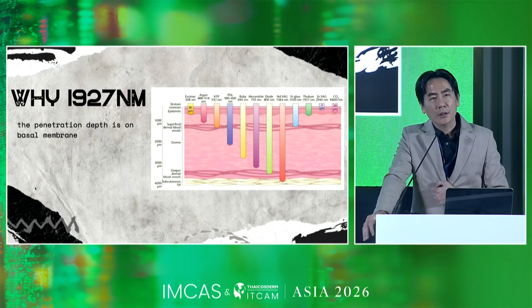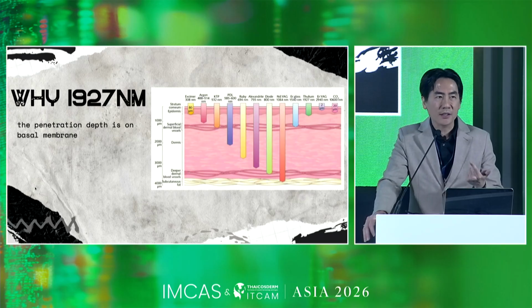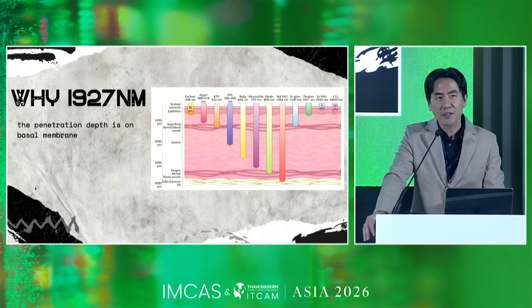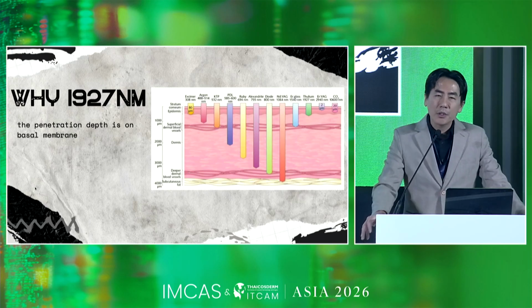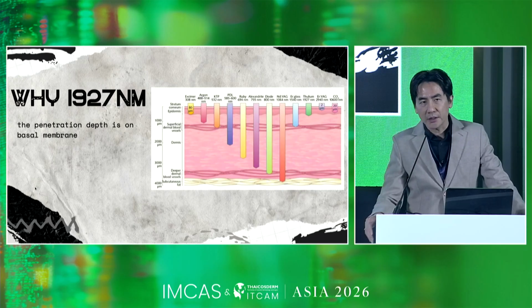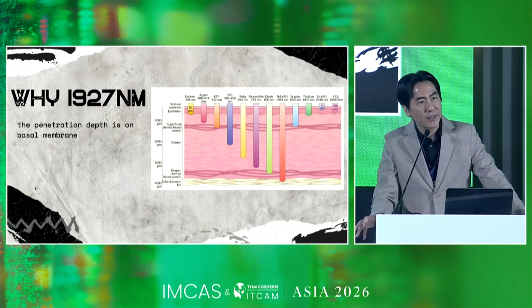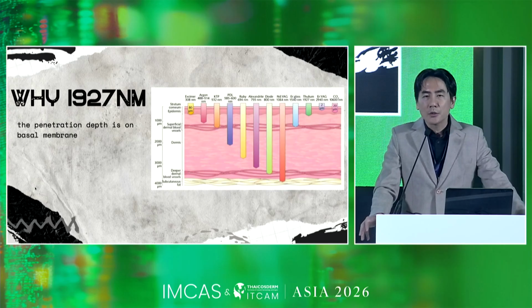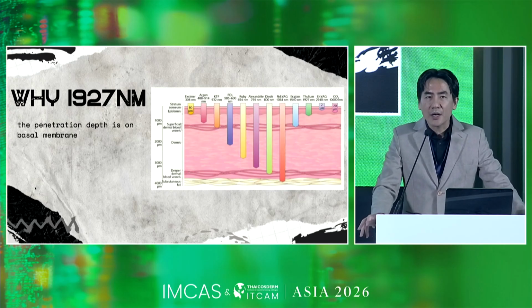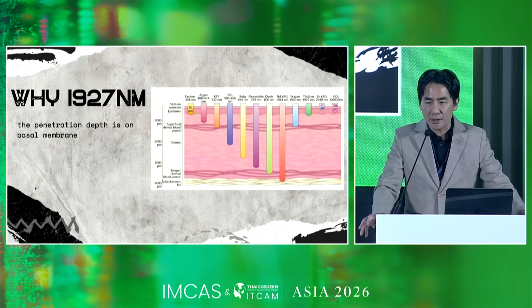I have these lasers that work on water chromophores, just like the CO2, the erbium YAG, the erbium glass, or anything else. To be noted, I have CO2 lasers in my clinics. I also have the erbium YAG, and the erbium glass lasers as well. So basically, I have 4 devices that work to destroy the water in our cells.